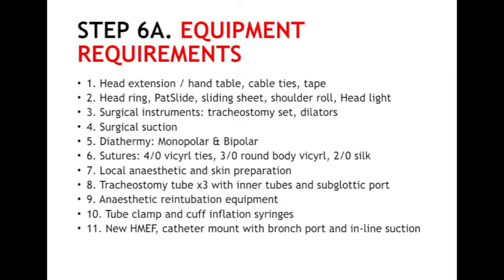It is important at this stage that the tracheostomy tube to be placed has both an inner cannula available and a subglottic suction port to allow endobronchial toileting in the post-procedure stage.